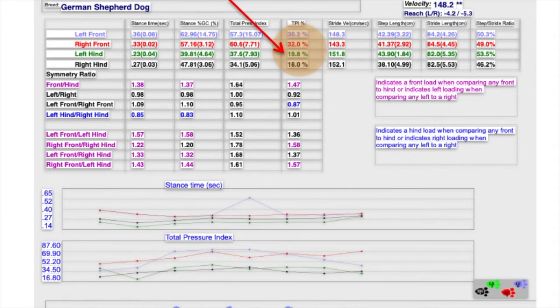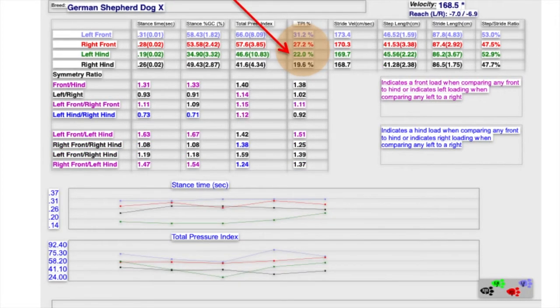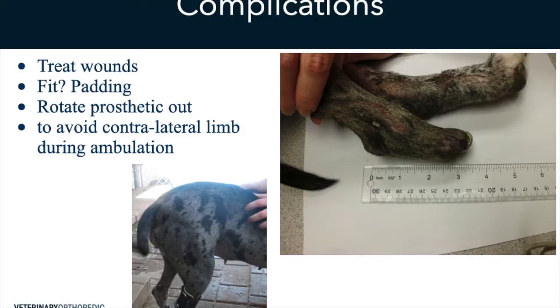So if you look here, we're loading the forelimb a bit, and we're not placing as much weight on the left hind limb, which is the one with the prosthesis, as we could be. Okay, so this is going to be something where we're going to make some adjustments, and now all of a sudden you can see here 22. So we've actually put more pressure now, the loading that we should be seeing on that limb.